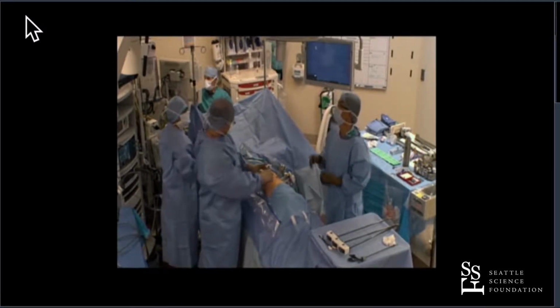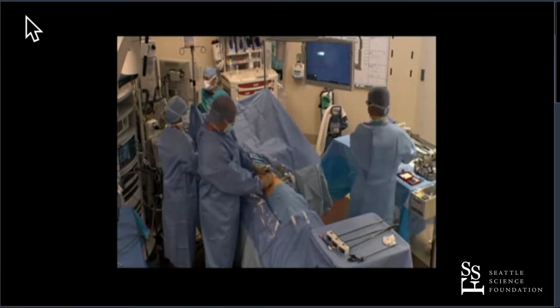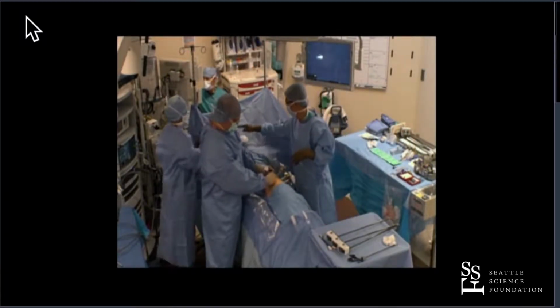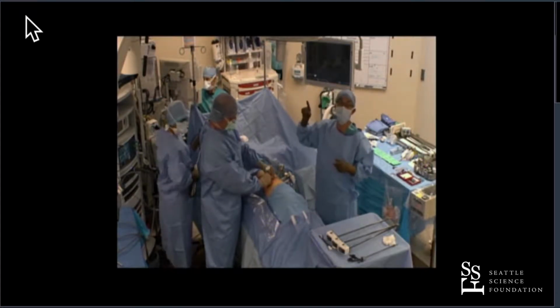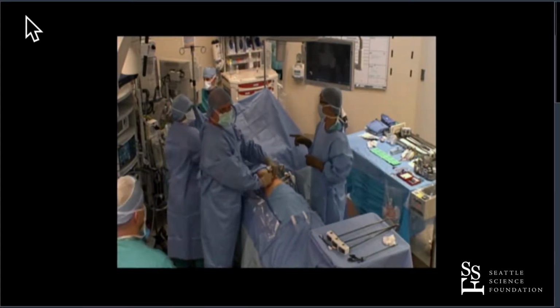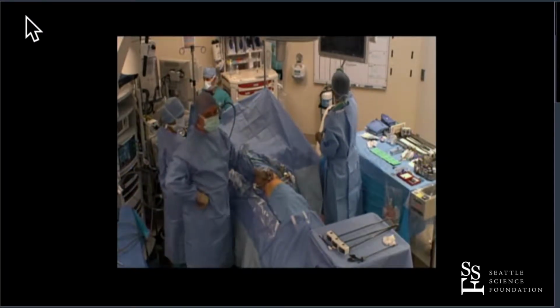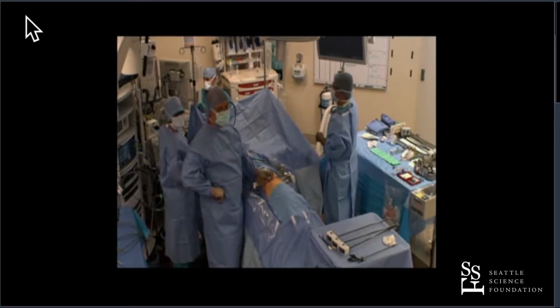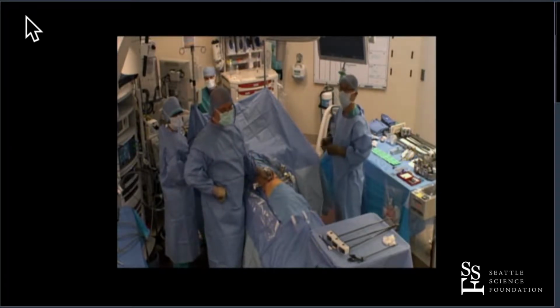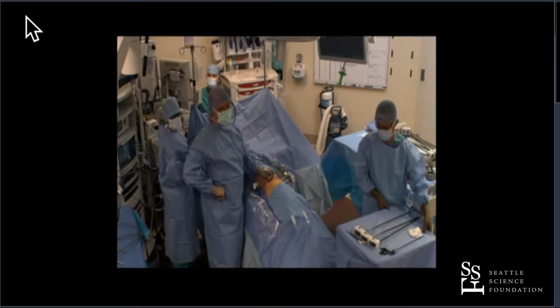I'll tell you what I do, and you can tell me that I'm wrong. I do the majority of the case in 30 up. Once in a while, I find it nice on the Xi, you can switch 30 up, 30 down very easily. For example, when I do the hilar dissection, I'm looking for the artery. Sometimes it's easier in 30 down than in 30 up. So I'll do most of the case in 30 up, and then use 30 down for the hilar dissection. Is that okay? Am I doing anything wrong? No, you've got to do what works. Whatever works for you is fine.